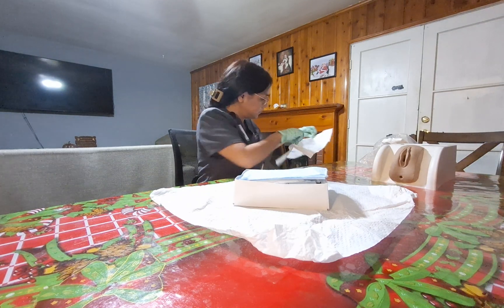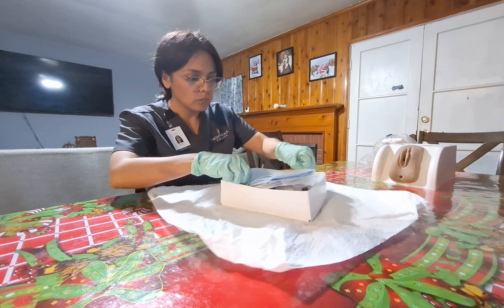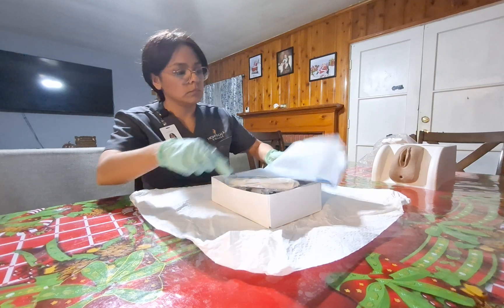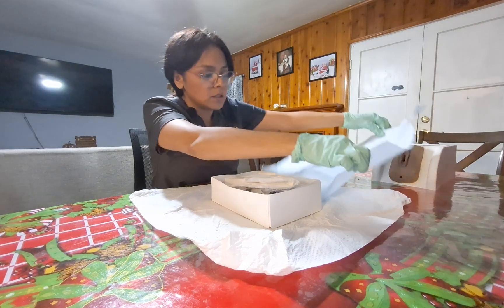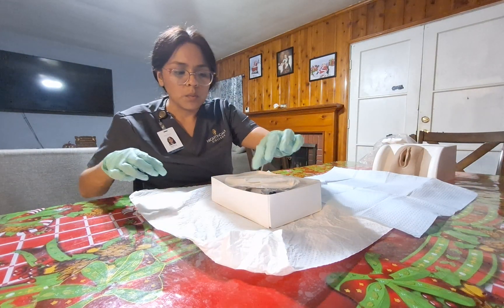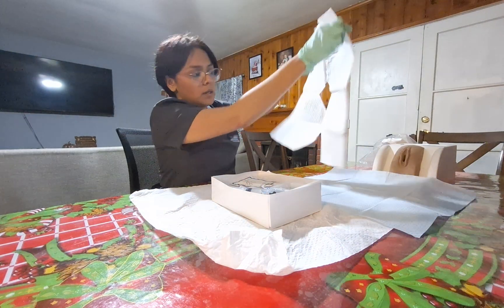I will toss the packaging and pull out my drape. Mrs. Garcia, can you please raise your hips so I can put the drape under you? Thank you so much. I will pull out the other drape and cover the area.